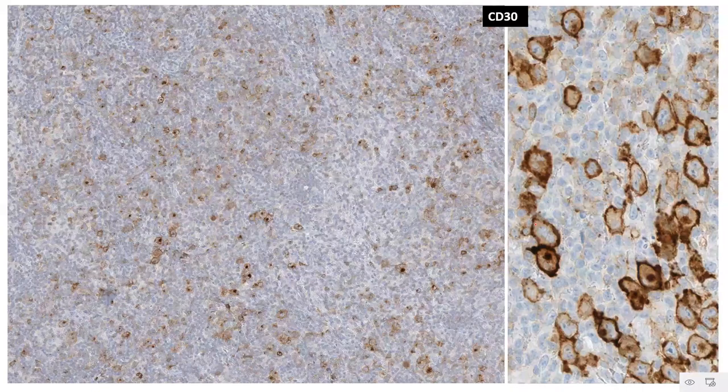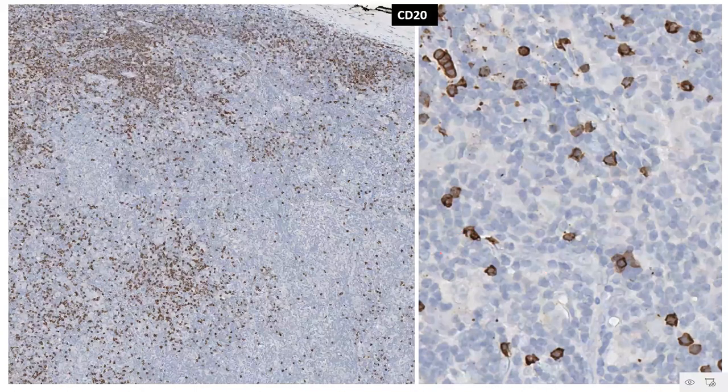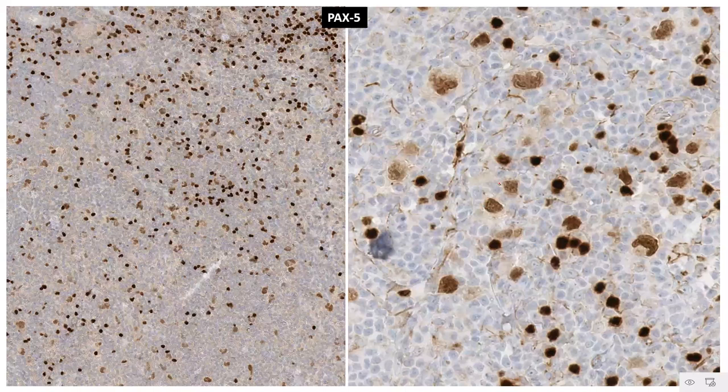Again, CD30 shows you a characteristic membrane as well as a paranuclear Golgi zone positivity within these cells. CD15 shows you the same pattern of expression, membrane and the Golgi zone. CD20 is seen to be negative within these cells, although it is picking up a part of the background population of the small B cells. The atypical large cells per se are negative. PAX5 shows a dim pattern of expression in the atypical Hodgkin-Reed-Sternberg cells. Dim when you compare it to the background population of small B lymphoid cells.